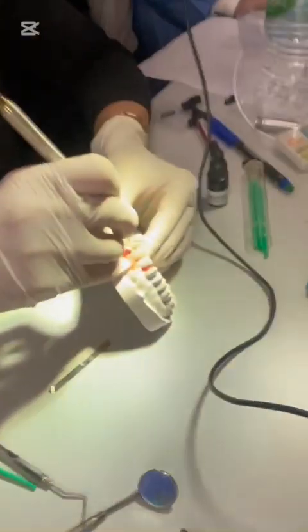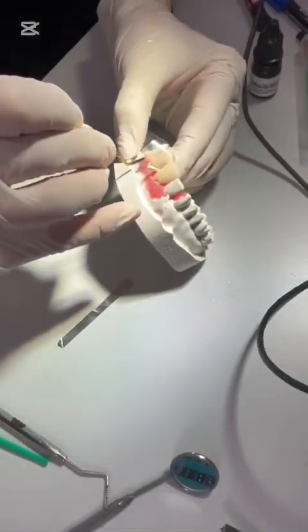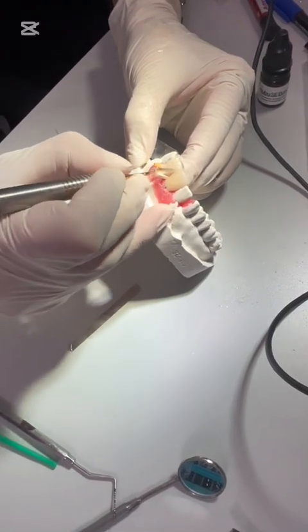Focus on this. Guys. Ben burada şey temizliyorum el aletini. Yapışıyor. I'm cleaning the hand instrument. Or if you have alcohol, you can clean it with alcohol.